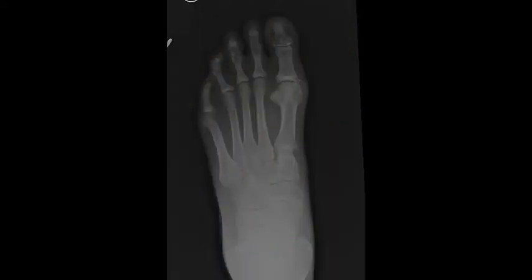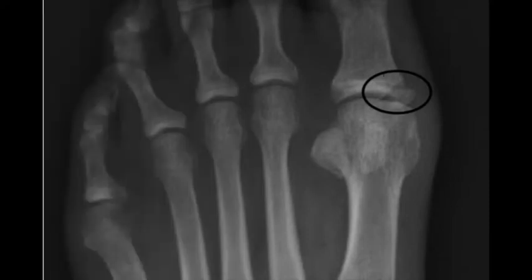X-rays of the left foot illustrate the proximal phalangus nonunion site, better illustrated above.